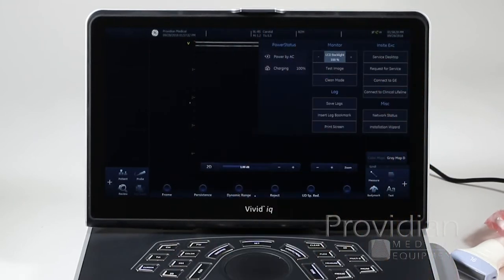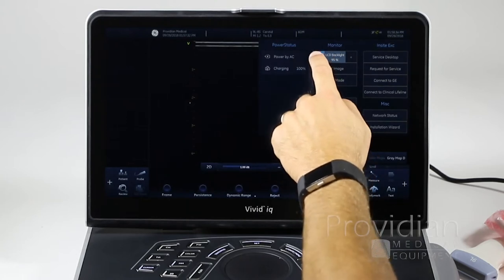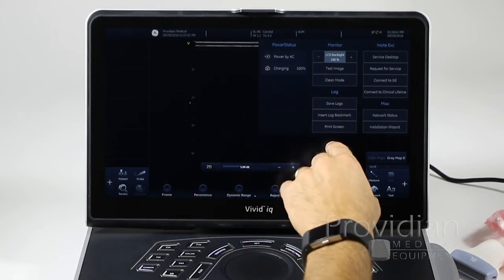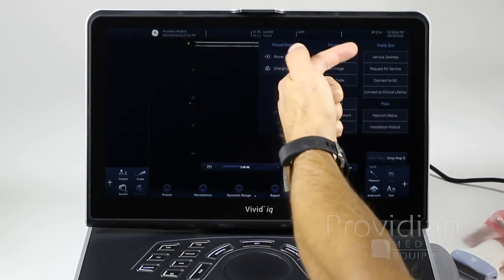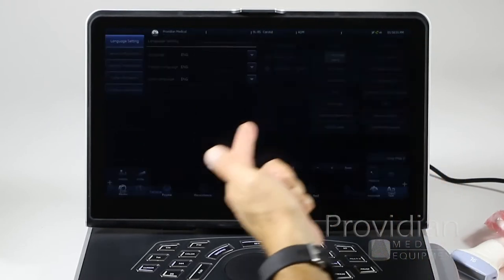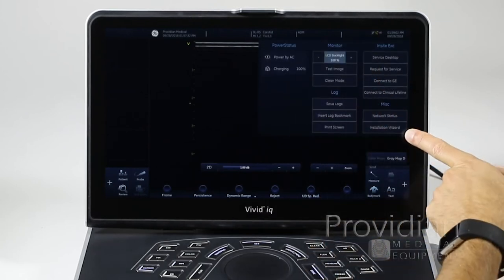If you tap up at the top, there's another set of options showing battery status, LCD backlight adjustment, test image, and clean mode — which locks the screen so you can clean everything. Don't worry about the logs; those are for system issues. Insight is the GE connection for support, and network status is there as well. The installation wizard option here lets you access it directly if it didn't pop up automatically on first boot.